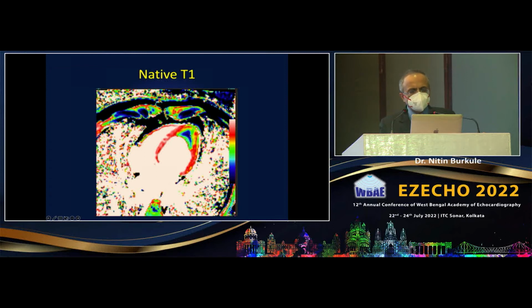Inside it, if I am thinking of a clot, it has to have a trapped plasma, that is water. Then the T1 value should go very high. So they should be something like in that white range. Instead, at the center of this filling defect, I get very, very low T1 values. And that is so distinct to see.